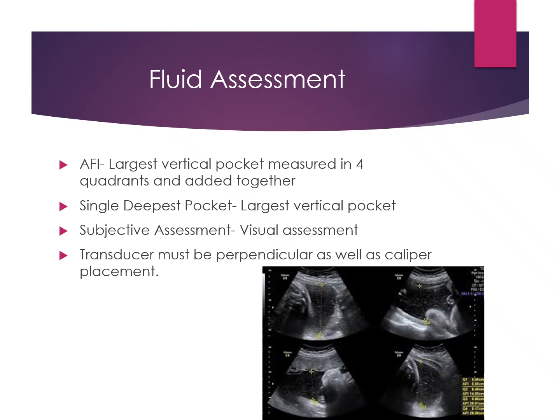One is that we have to stay perpendicular to the fluid, and we have to measure perpendicular to the fluid. So it needs to be straight up and down, anterior to posterior measurements, and keeping your camera straight up and down. We do not angle through fluid because this could give a false numerical value for what the fluid really is.